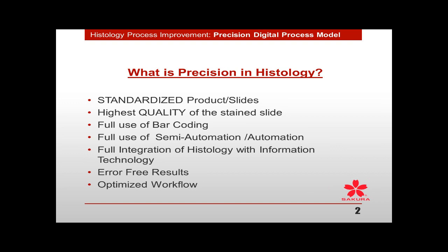I'm going to tell you that you have to be bringing barcoding into your laboratory if you don't. It's one of the necessary things to effectively use integration of your process, the digital scanning, and your LIS system. That's virtually impossible to do, this seamless, we hope to get to seamless integration, without barcoding.